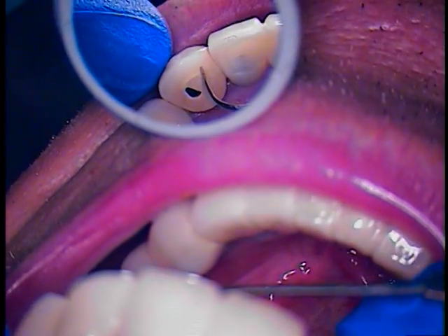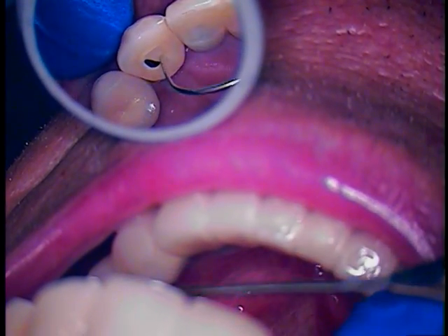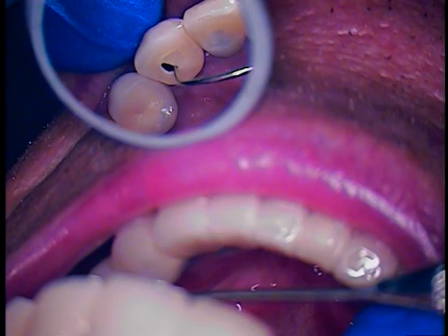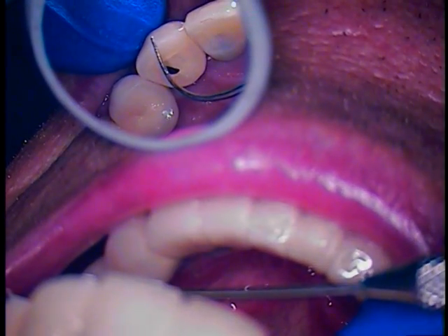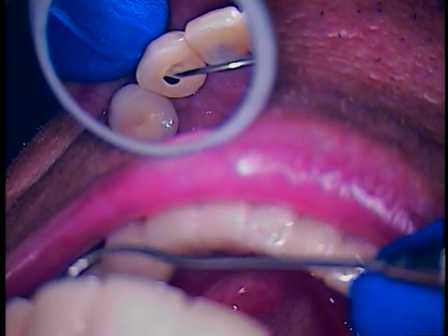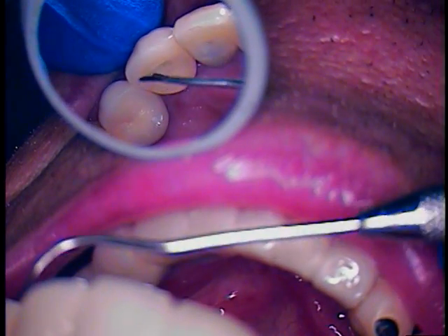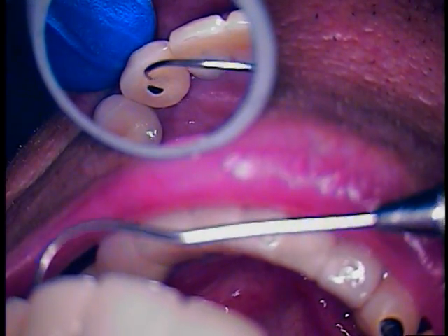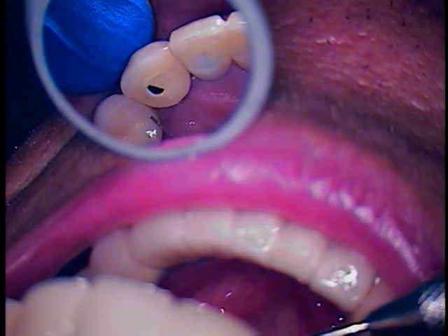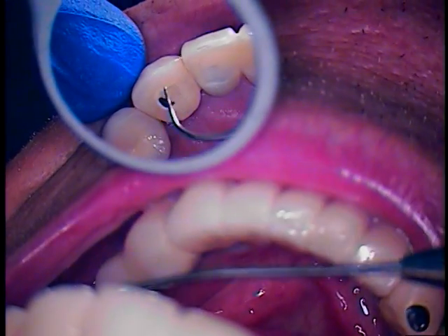Today's mission is we're going to take care of a Straumann implant crown and abutment. We have a loose basal screw within the abutment itself, so we're going to have to make access. Our protocol will include first stabilizing the loose crown, then gaining access through the lingual aspect. Once we find the basal screw, we'll make sure we have a long line of access for the driver to go and engage the head of the screw. Unscrew everything, put it in a cleaner, then start our cleanup with the soft tissue and the implant, checking the threads for any damage.